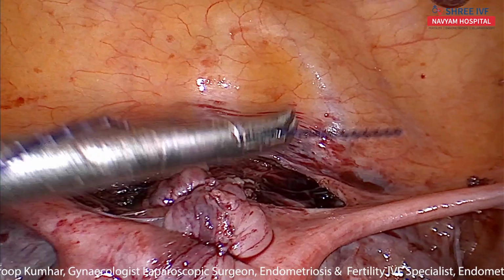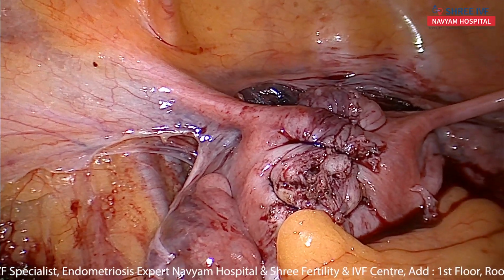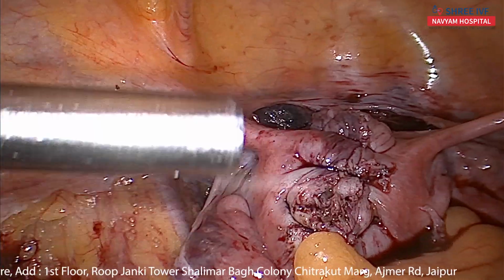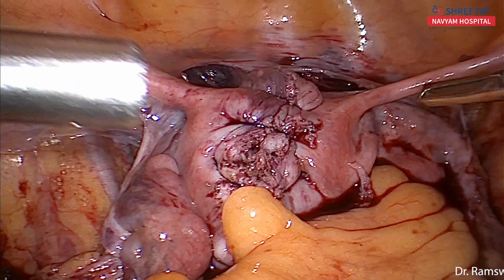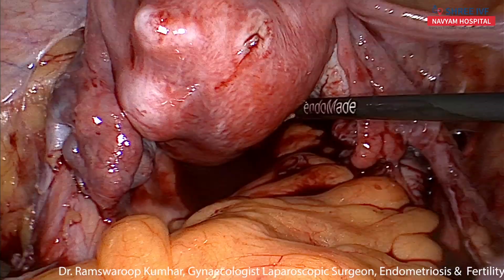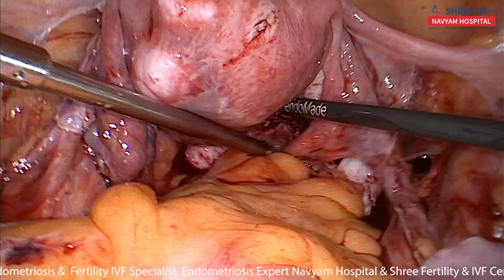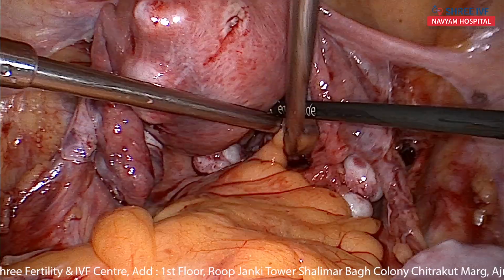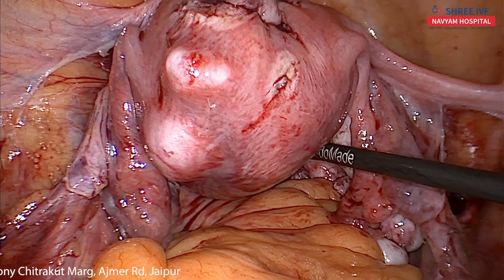Now we will remove the suture and we will proceed for the posterior wall myomas. Get some suction, please. There is no more blood loss because of bilateral uterine artery ligation.